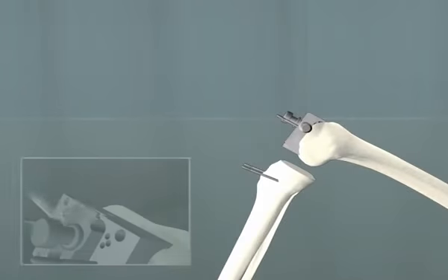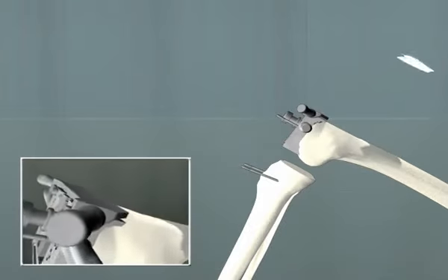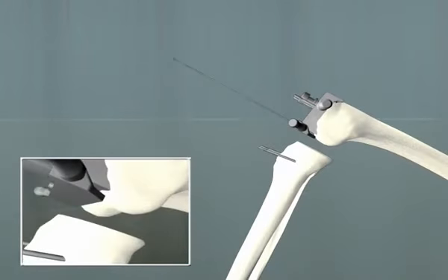The anterior femur is then resected with a power saw through the capture plate. The capture plate is then removed and placed on the inferior portion of the guide, and the posterior femoral condyles are resected with a power saw.